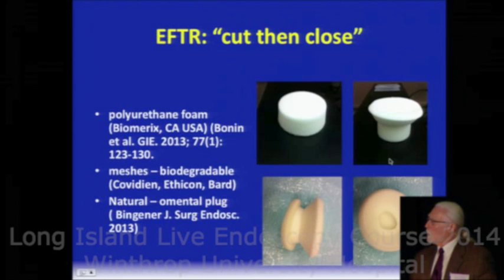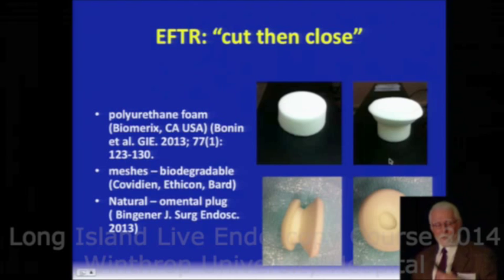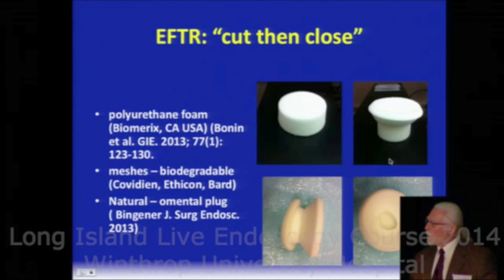We're currently working using a type of foam plug. It's a foam that's biointegrative, meaning it allows cells to grow into it, and it's also biodegradable, and it'll degrade over a point in time and allow the closure to complete itself. Probably could be done with meshes as well. And as I mentioned, the most natural plug that can close things confidently is the omentum.